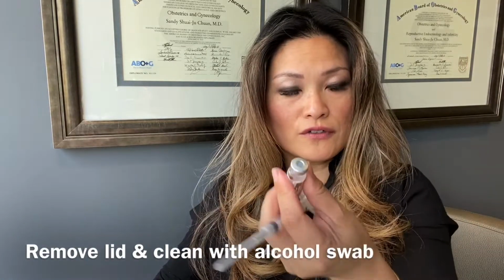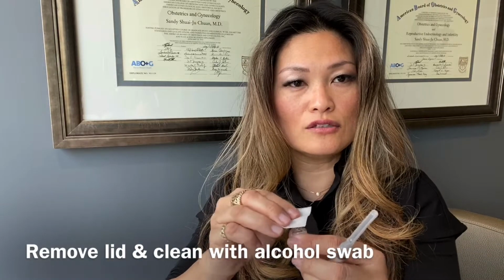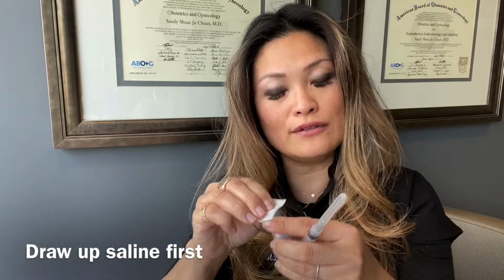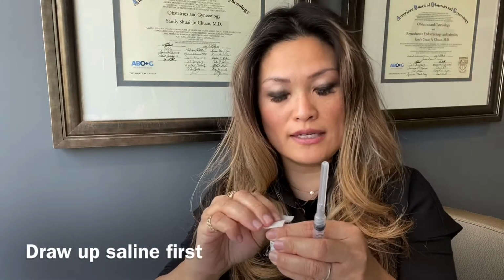So what I'm going to do first is clean the top of the vial of the saline, because I need to draw up the saline first. And I'll usually go ahead and clean my Menopur as well, because I know I'm going to be using it shortly. So I'm going to sterilize that, okay? Anytime before you put a needle into anything, clean it with an alcohol swab. It will never be the wrong decision. Always clean, clean, clean, okay?